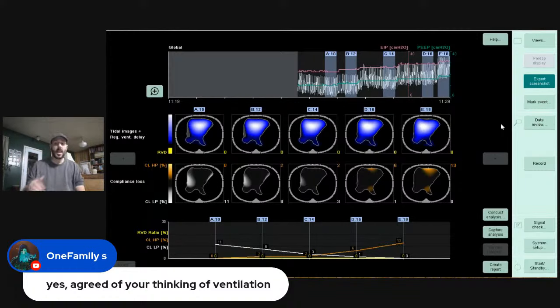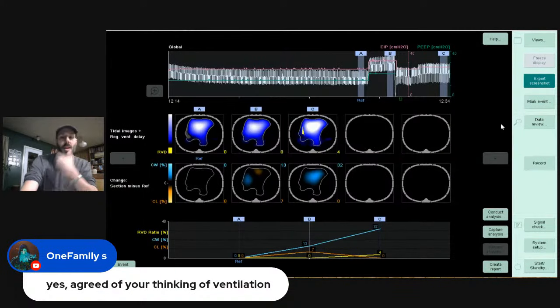And it's not only that. I always like, oh great, the patient's going for a chest CT. I want to see the chest CT, to see if there's any atelectasis, consolidation, and stuff like that. But that's just a snapshot in time when they took it. This is at the patient's bedside. It's a belt. You can put this on the whole shift. It's breath per breath. It's dynamic.